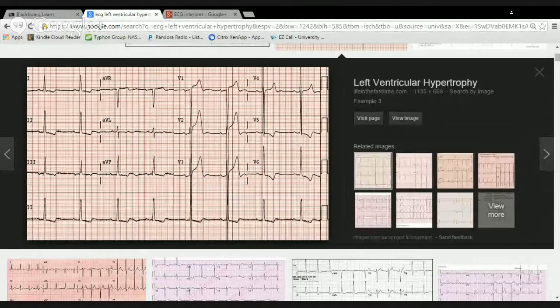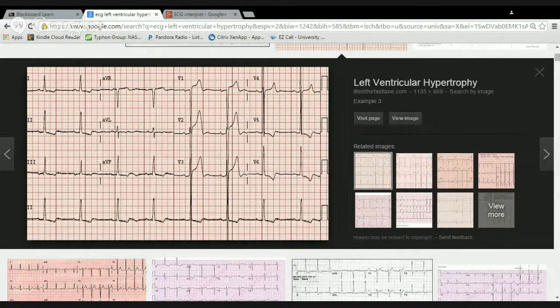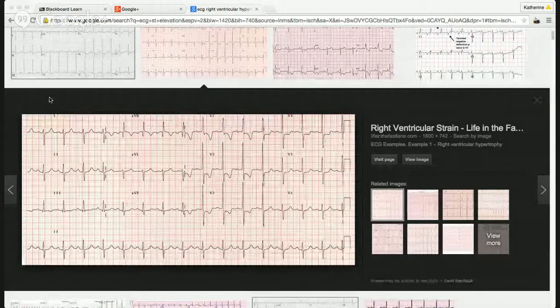Do you have mine? Okay. I'm looking at yours still, actually. Why am I looking at yours? I don't know. Okay, so where's mine? No, yours is up now. Okay. Can I use your little card? Thank you.